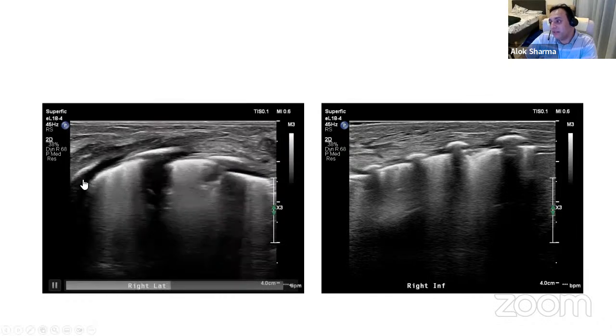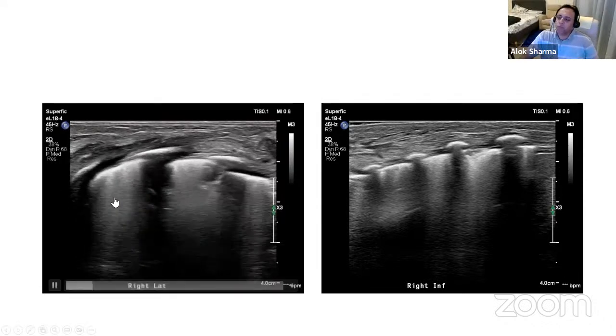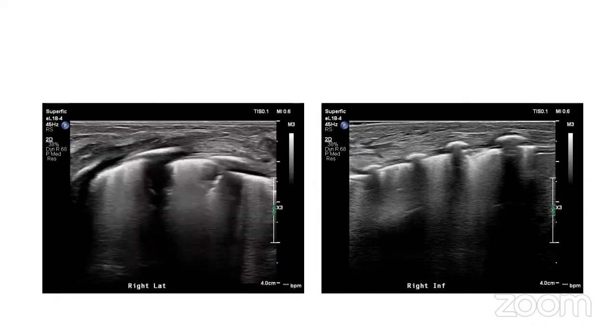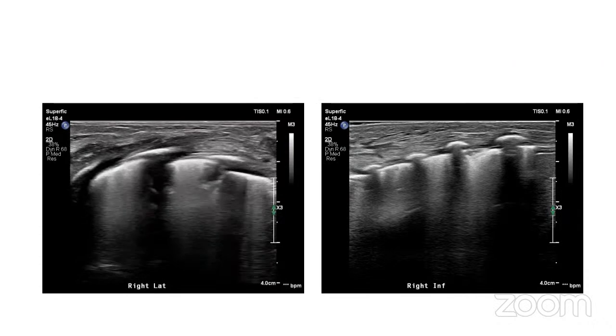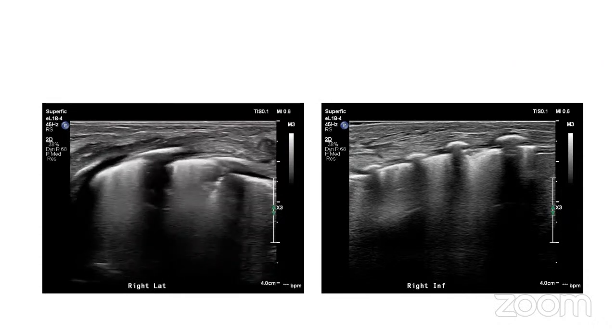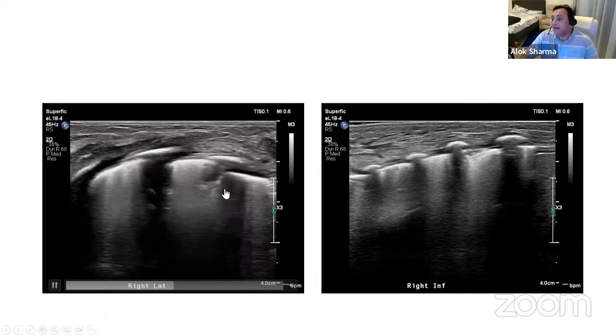Now, the reason I want to show you this is, let's let you describe it first. Go for it. Yep. Here the pleura is sliding. I think it's regular. Also, at the right side of the image, maybe regular. And yep, B profile for sure. I don't see any A line. Yep. And in the right side of the picture, I don't know if this is a consolidation just below the, yes, this one. Okay. I would probably agree with you. That looks like a consolidation to me at this particular point. And it's definitely below the level of the pleura. It's subpleural in its nature.